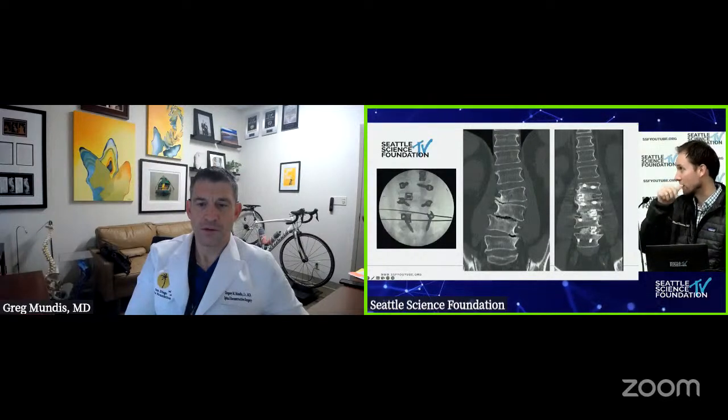And it's not well shown on these x-rays. It's maybe a little better shown on the CT, actually. You can see that we kind of asymmetrically placed those cages. So just one cage per level. We were able to pop open that side at L4-5 on the left, you can see, and also at L3-4, and then place one on the right at L2-3. And then we were able to compress across that side to realign things. And that's just a photo from the OR showing us putting those in.